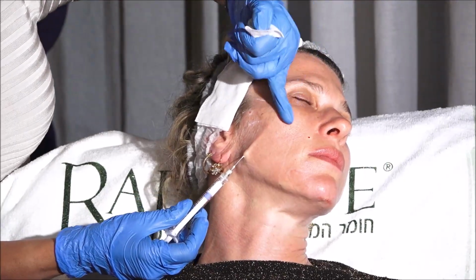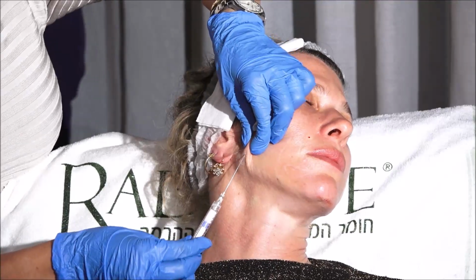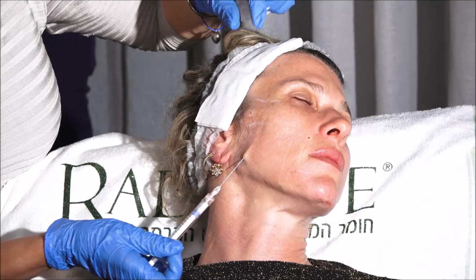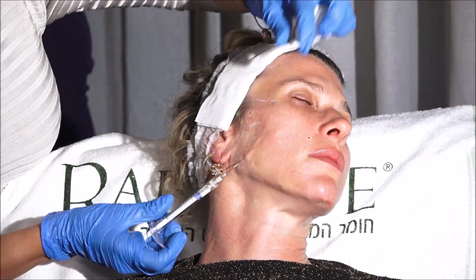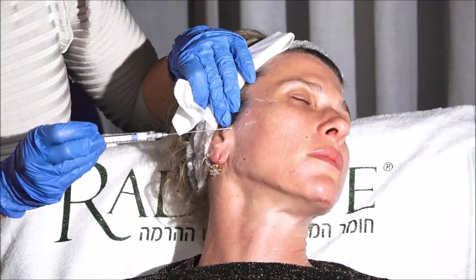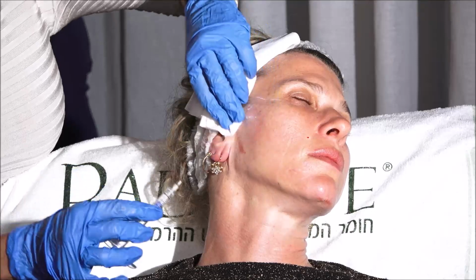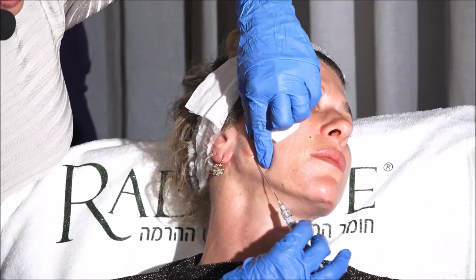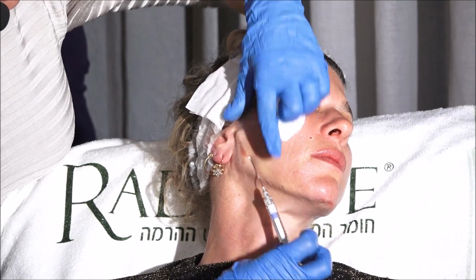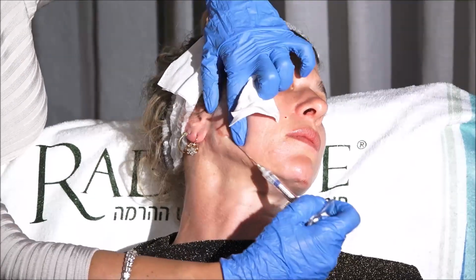So I connect the point of the zygoma with the angle. Very superficial. For some people, you see this area, preauricular, starts getting wrinkly. You can take the same point like this, and you can treat this area.